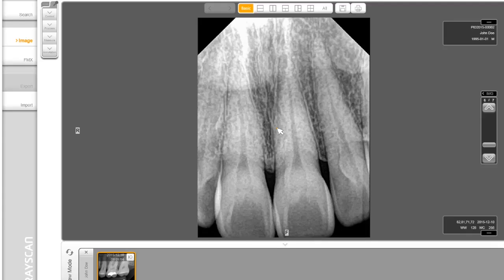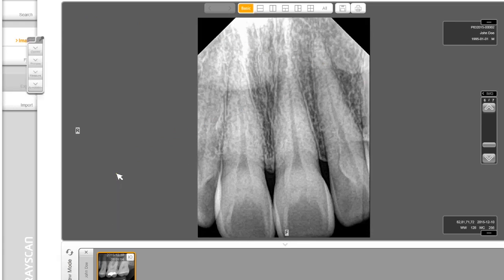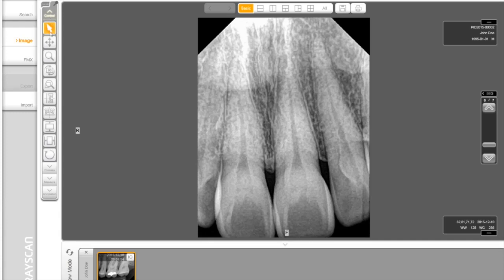Utilizing tools in RIOView. You have a series of tools on the left side. To expand or collapse any of the modules, simply click on their associated icons. If the toolbox is not in locked mode, it can be customized to display the desired toolbox option. In the top corner, you have tools in different sections. The first section is the Basic Control Manipulation Tool.